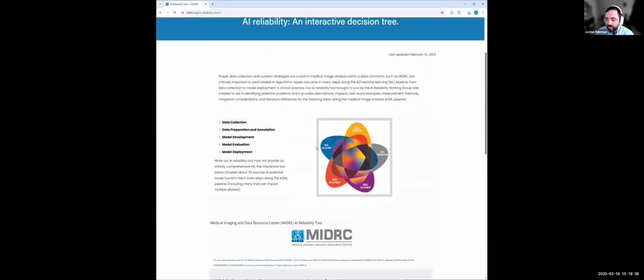that shows this really complicated Venn diagram. It shows all the different phases of an AI development process, all those different steps, and how different sources of systematic errors can exist in all of them and even be parts of both of them.